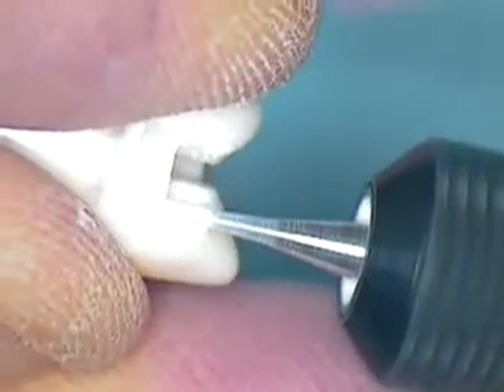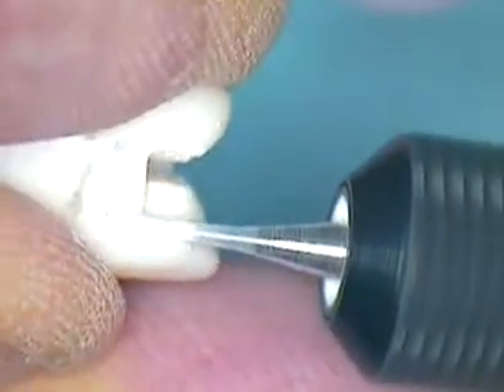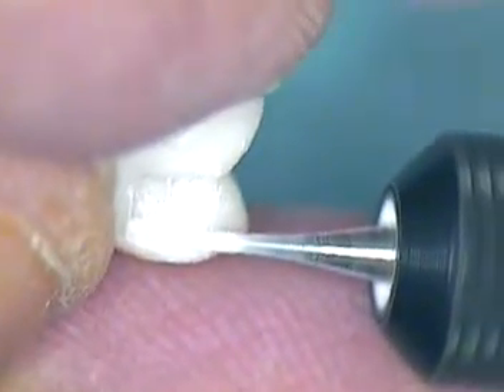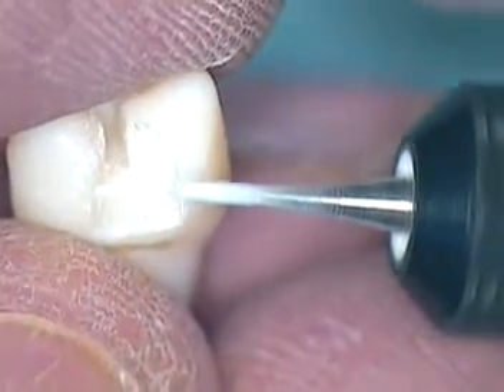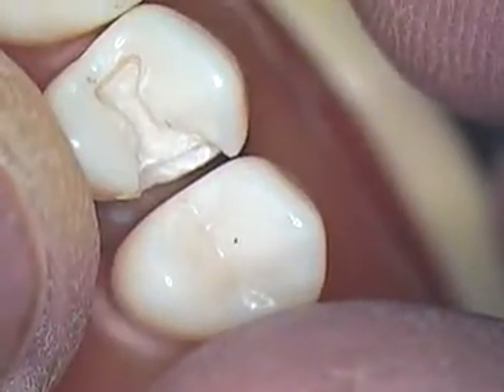In other words, you would bring the S out more toward the buccal if you're using a tooth-colored restoration — it won't show. And on the distal, many things don't really show in a smile. So I decided to bring it out a little bit more and develop my S. Let's see if that's all it took. Lightly touch it this way — that should be more than enough to break the contact. We'll take another look. Yes, we did break contact, so I'm happy with that.